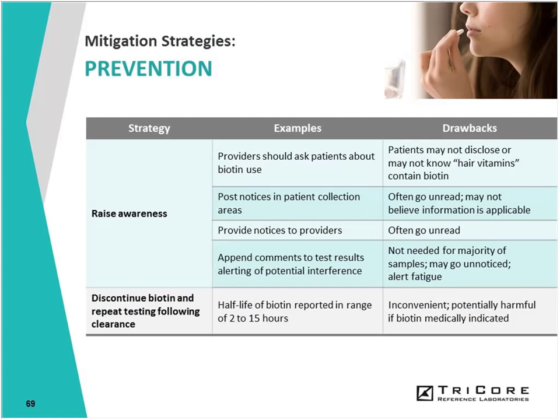And patients often don't even realize they're taking biotin supplements because some products are just simply labeled as hair or nail vitamins. And of course, notices that we do push out to providers and patients often go unnoticed and unread. Another strategy would be to append comments to test results alerting to possible interference, but I really think that would be overkill for many tests and would likely lead to alert fatigue and eventually just be ignored.